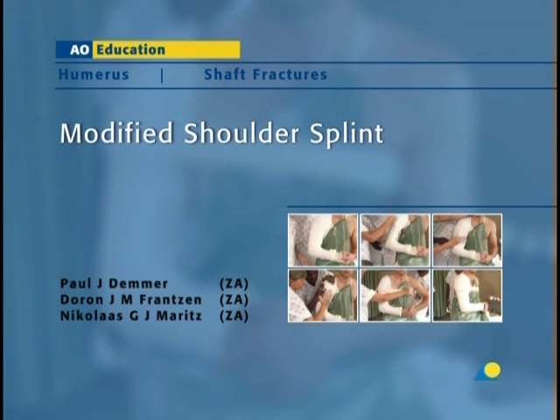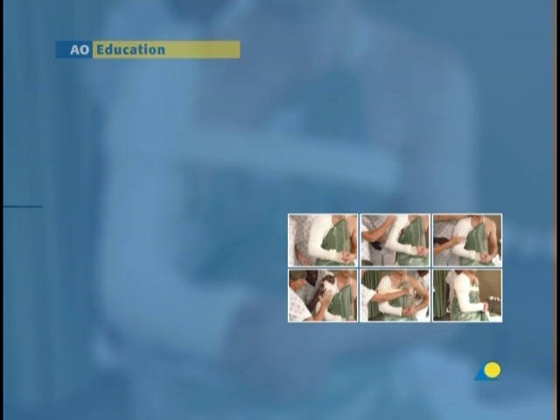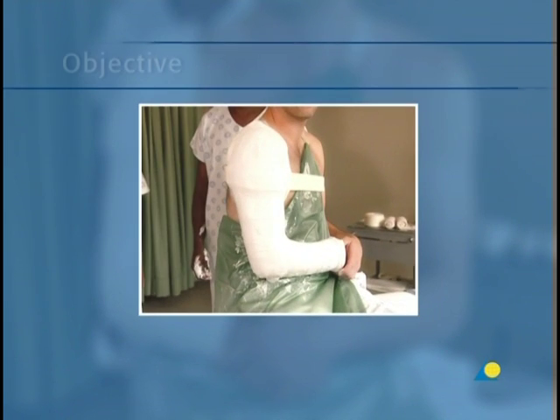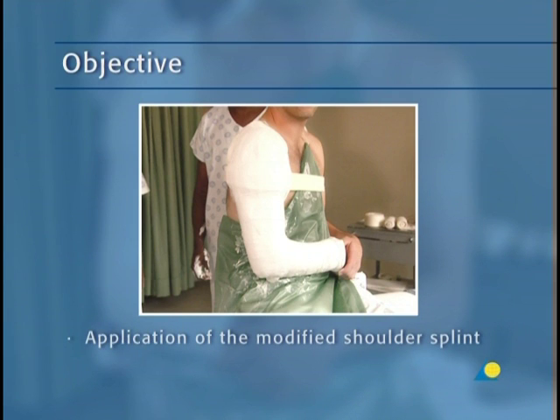The modified shoulder splint is used to immobilize shaft fractures of the humerus. In this presentation, the application of the modified shoulder splint will be demonstrated. The objective of the exercise is to understand the correct application of the modified shoulder splint.